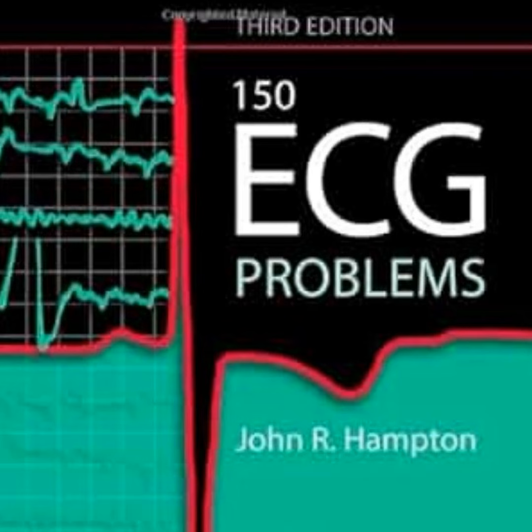Specifically, it stretches and disables the left bundle branch. And there is your LBBB on the tracing. Exactly. So the structural collapse actually precedes the electrical collapse.